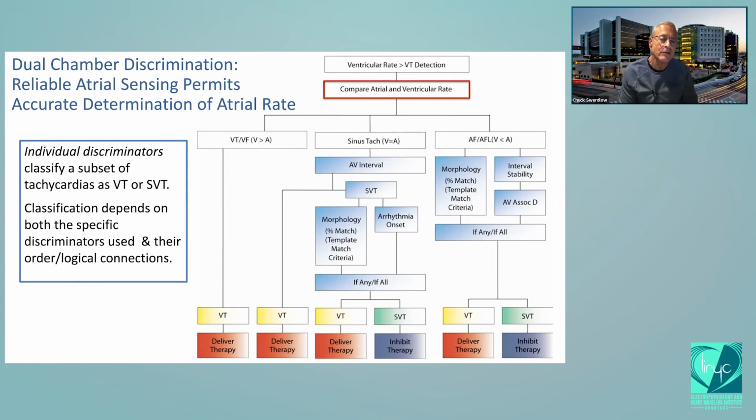This is a good example of not updating your technology. Wavelet came out, the first paper on Wavelet was published in 2002, and it identified all the major failure modes of the algorithm. The algorithm remains unchanged in transvenous devices 20 years later. If you use the same software on your computers that you used 20 years ago, it really wouldn't be what we expect, right? Of course.